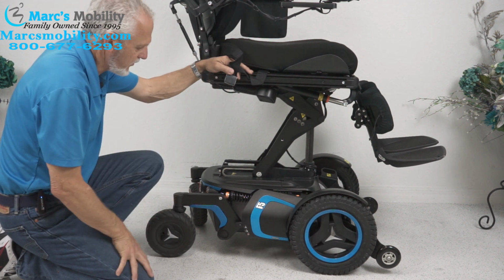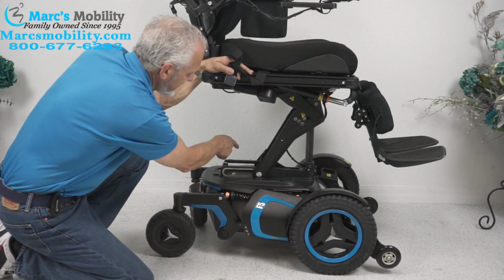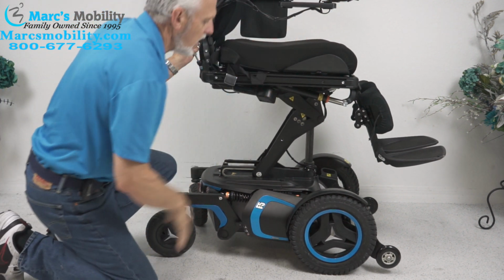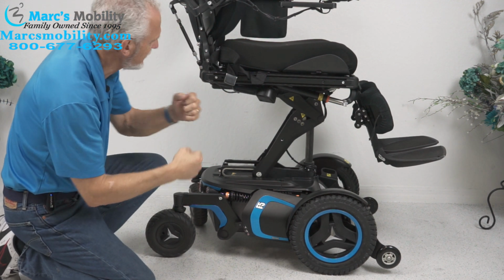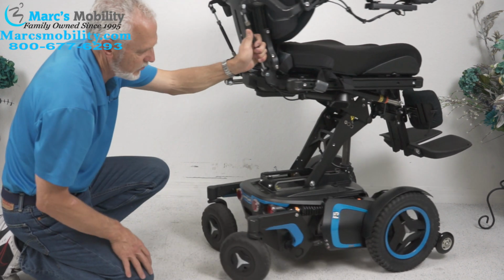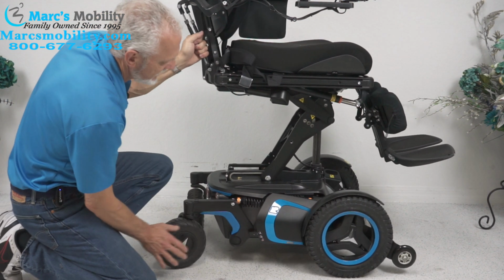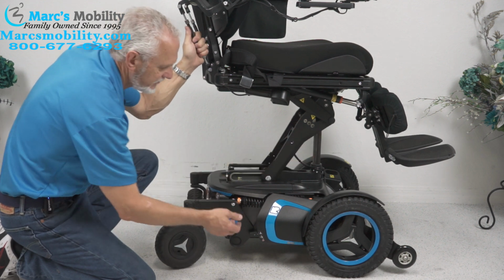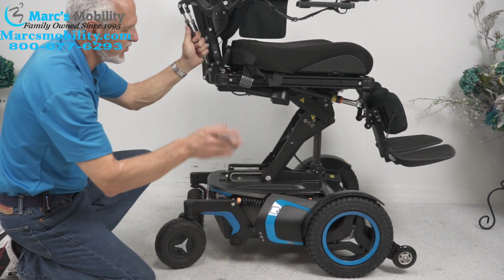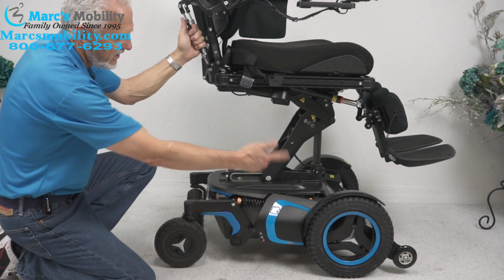It's a lot of metal, a lot of motors, okay? There's a motor for each wheel. There's a motor for this wheel right here. There's a motor on the opposite side for the other wheel. If I want to push this chair, well, it's in gear. What I would do is turn the power off, and you want the power off so you have no resistance in the motor. You see the little handle right here. If I push it down, what that does, it unlocks the wheel. You can see the drive wheel is moving freely, okay? So that's how you do it. You have to do both motors, then you can roll it and you can move it around. But when you're done, put it back in gear. Because if you leave it in neutral, everything's going to light up, nothing's going to work. Okay, back in gear.